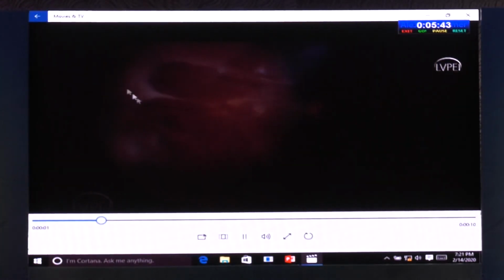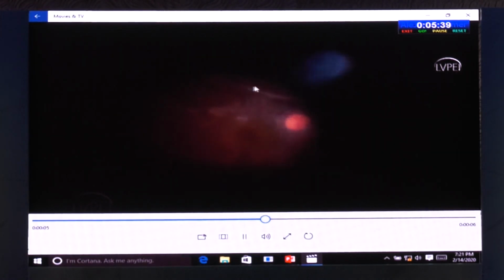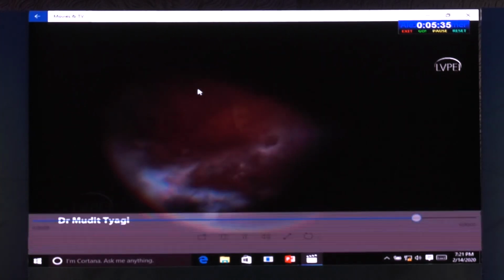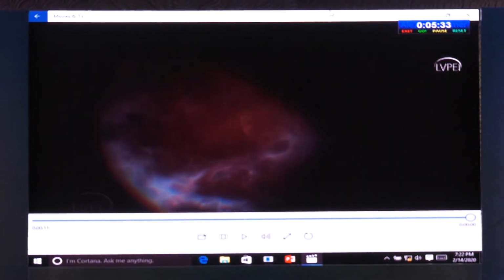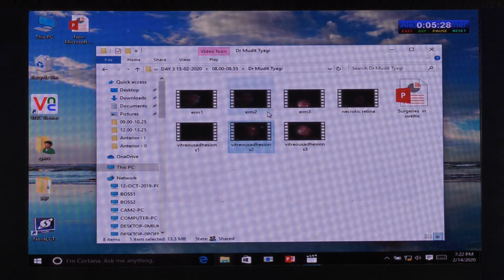So if you look at it, these eyes have extensively thickened vitreous adhesions in the periphery, and if you look at all of those, these vitreous adhesions need to be tackled. Somehow the characteristics of vitreous in eyes with uveitis is much different than what you see in a routine eye. This vitreous is much thicker, and there are a lot of opacities.